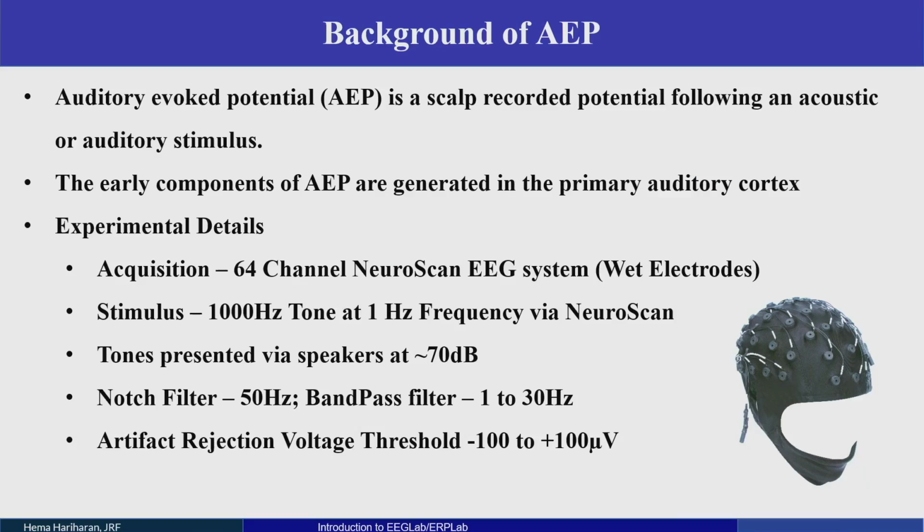First I'll give an overview of what ERPs are. ERPs are event related potentials. Our brain has various points over the electrodes. The brain is stimulated due to an event. A stimulus is given to the brain, based on which a response is obtained from the scalp. That is called the event related potential. So based on an event, we are evoking a potential. A biopotential is obtained from that, and that is called the event related potential.